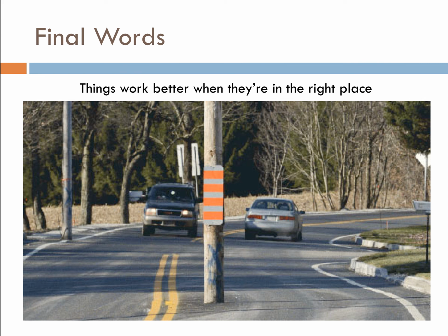It's also very loud, and there have been cases where people who have been subjected to war and those sorts of activities find the clack, clack, clack of MR quite confronting. So, as I say, it's about balancing all of those concerns and outcomes in order to make the right decision.